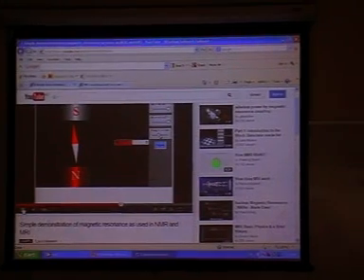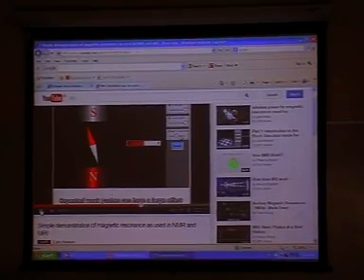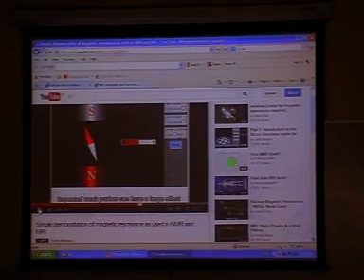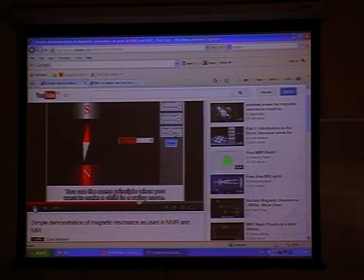So he's adjusting the frequency. See now? Repeated weak pushes can have a large effect when applied in synchrony with the natural oscillation. This is a resonance condition. That's a resonance condition. You use the same principle when you want to make a child in a swing move.